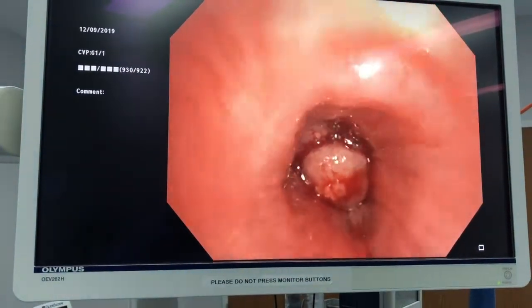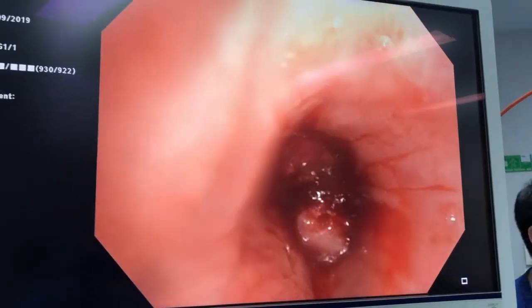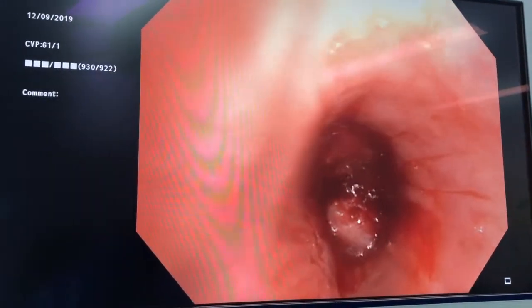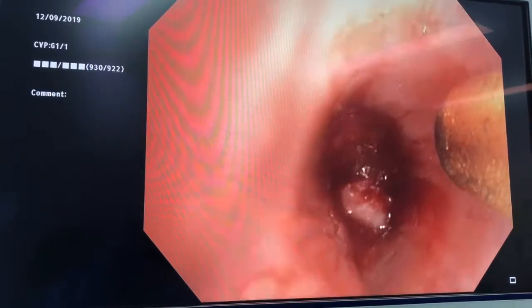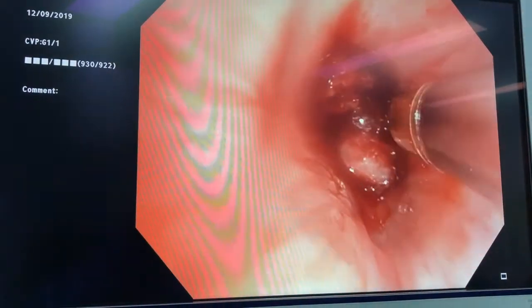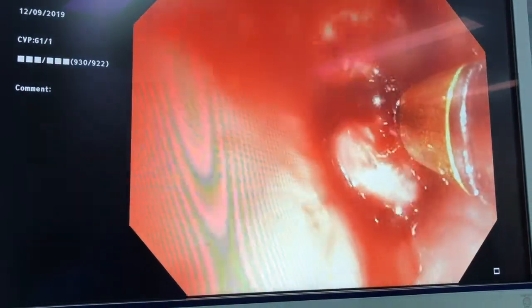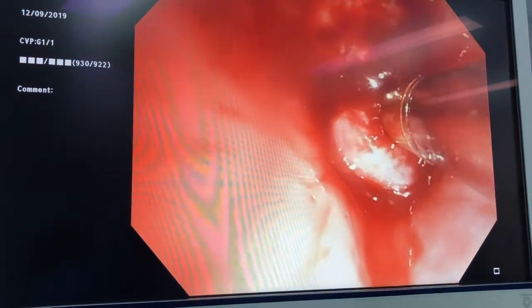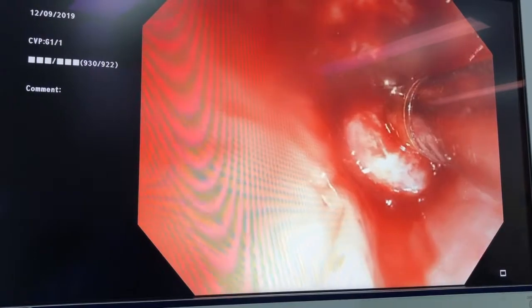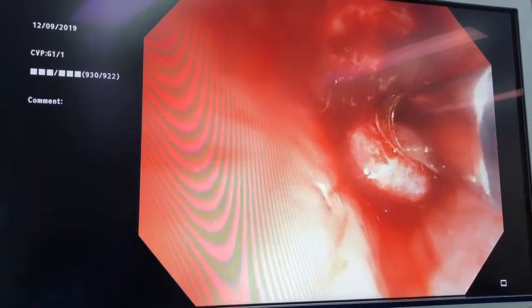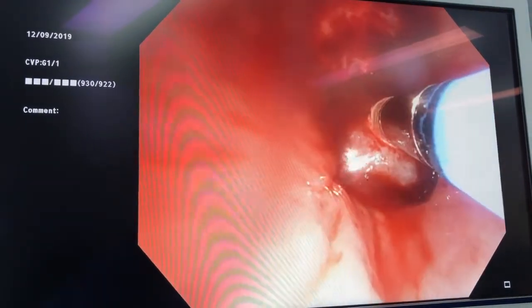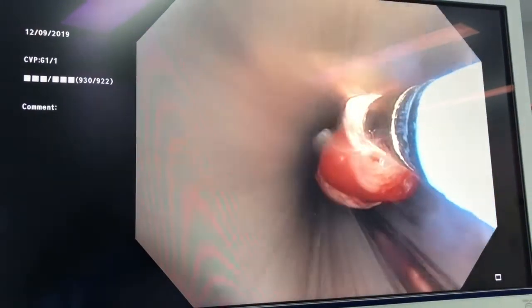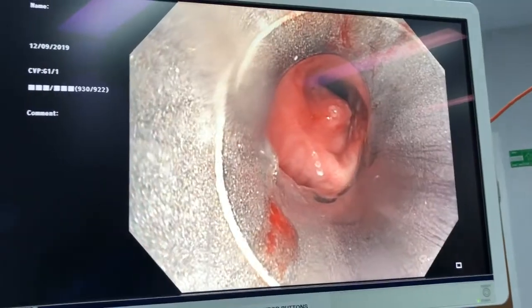Now I'll use a cryoprobe to freeze onto the tumour, because that'll stick to it and allow me to remove it out through the rigid bronchoscope. There's the cryoprobe — it freezes very quickly and grabs onto the tumour, and you can see it being removed.